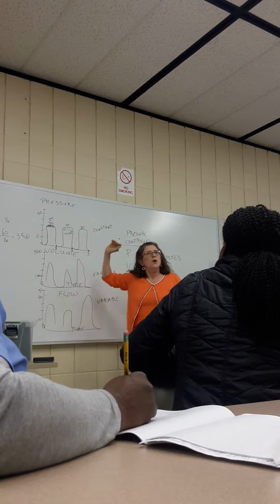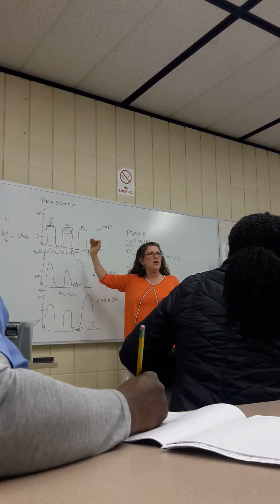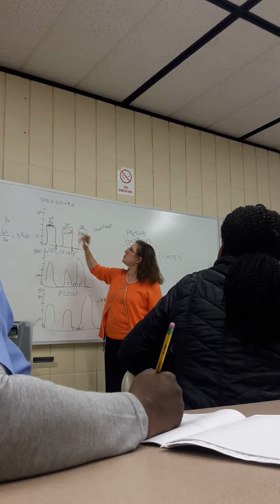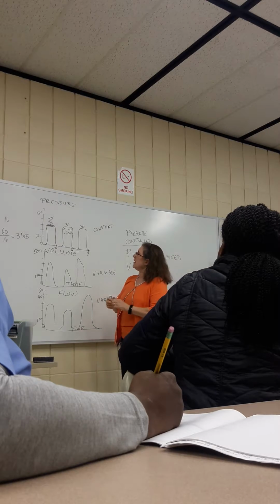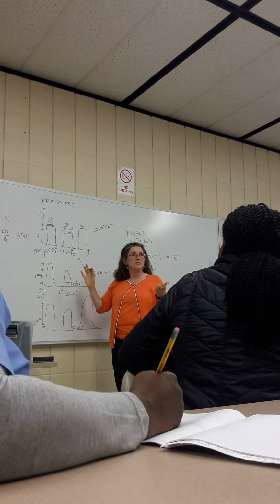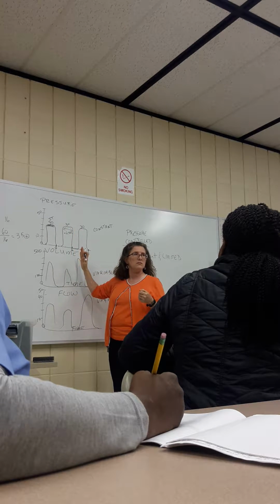How is it cycled? Cycle is what ends inspiration, right? So how do we know what the cycle is when we're in pressure controlled ventilation? I put it in for the inspiratory time. Once it got to 0.6 seconds of inspiration, boom, it's done. That's when inspiration ends. So it is time cycled. It goes for a certain amount of time, and then it's done.